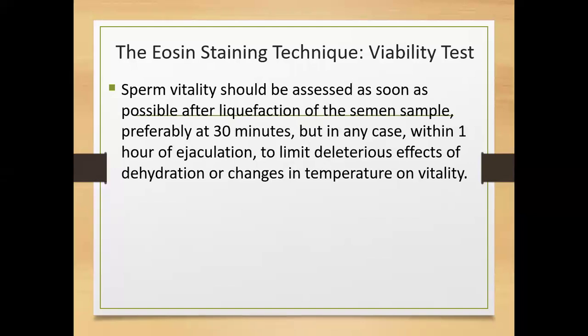Sperm viability should be assessed as soon as possible after liquefaction of the semen sample, preferably at 30 minutes or within 1 hour. You know why? Because as time elapses, temperature can cause sperms to die. At the end of the day, we are going to see those who are actually dead.